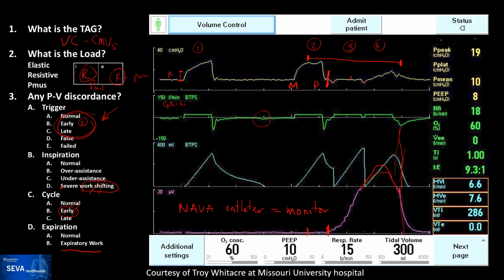Yeah, they were worried because his airway pressures were high, but it was really all the airway collapse that this patient was experiencing. He had a stent in, but the other parts of his airway were collapsing, and I don't think the distal parts of the lung were seeing some of the pressure, but this was after they had deeply sedated him before we paralyzed him. We only paralyzed after this continued and the tremendous amount of air trapping that the patient was experiencing.